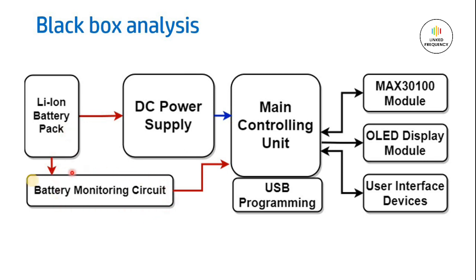Thereafter, we will be using a battery monitoring circuit so that we can monitor how much charge is left in this battery and indicate how much time this project will work for. Then we will be using a DC power supply or DC to DC converter, which will convert the high voltage of the lithium-ion battery pack into the required voltage for the entire electronic circuit that we are connecting.